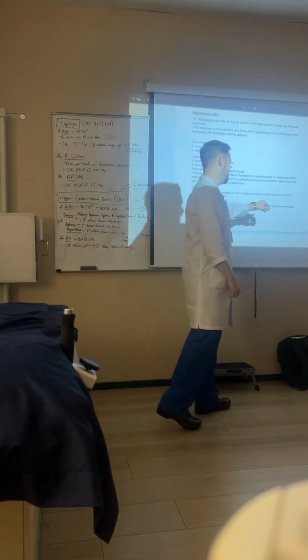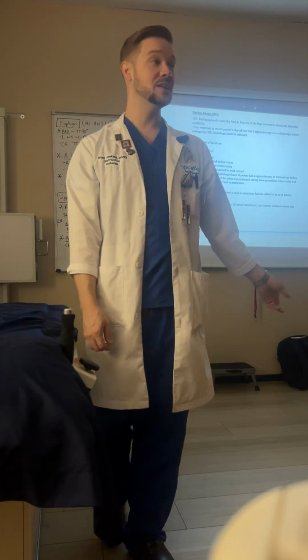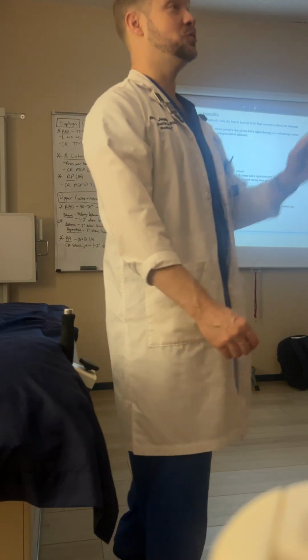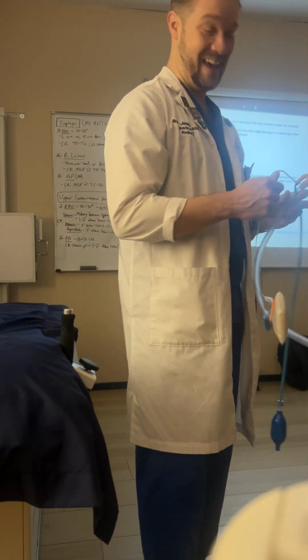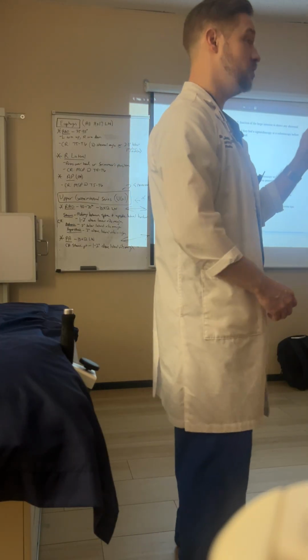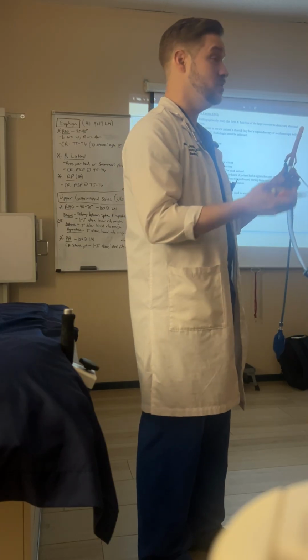And the air contrast retention enema tips. I'm glad Mr. Ubaldi let us know that they are all intended for single use. So please don't try to reuse the enema tip for all of your BE patients. That's very important. So this would be one that you would use for double contrast BE. You could use it for either, but you can also use it for double contrast.